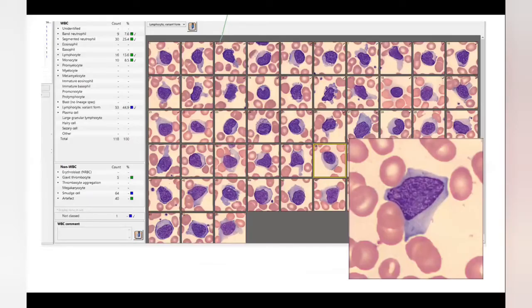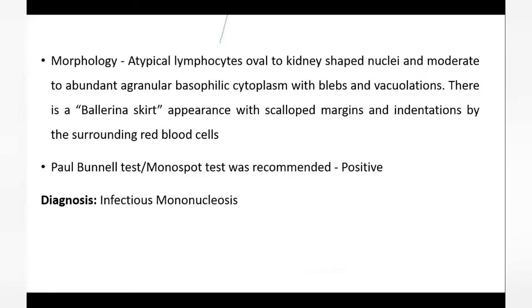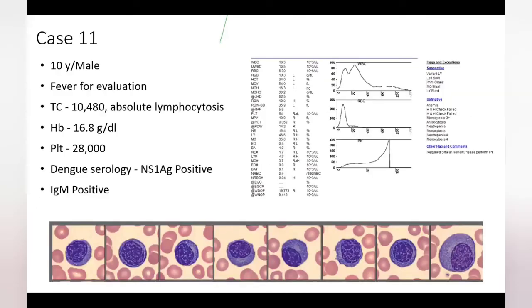are transformed lymphocytes. So you find those lymphocytes with abundant cytoplasm and the skirting and the different shapes of WBCs, but they're all benign. They're just reactive in nature, and it shows the classical, what we call as the ballerina skirt appearance. The advantage is you find something like this, you can quickly ask your patient to take the next steps, whatever be the test, gold standard test that is recommended for EBV infections, and determine whether it's a case of EBV virus. In this case, yes, it was an infectious mononucleosis.